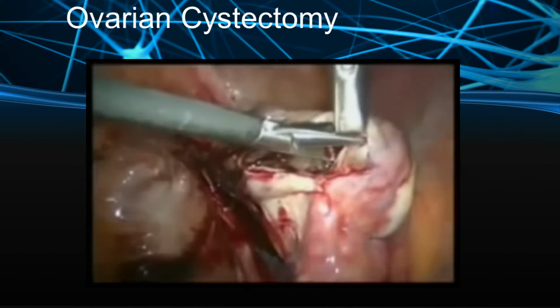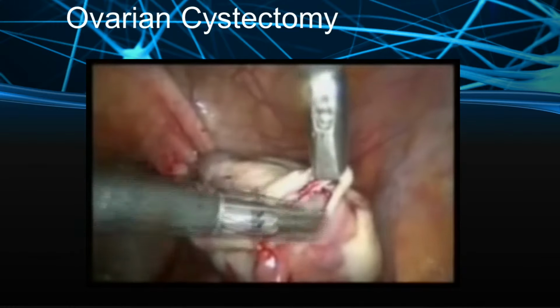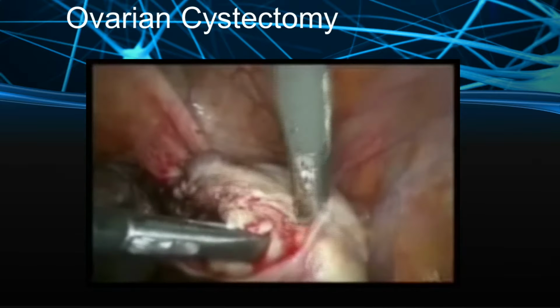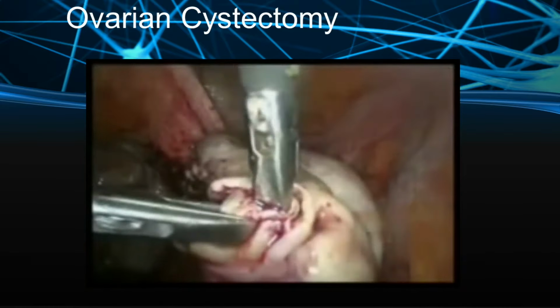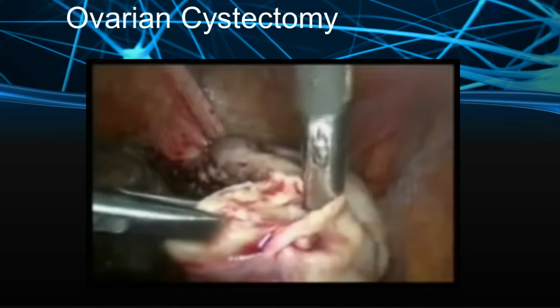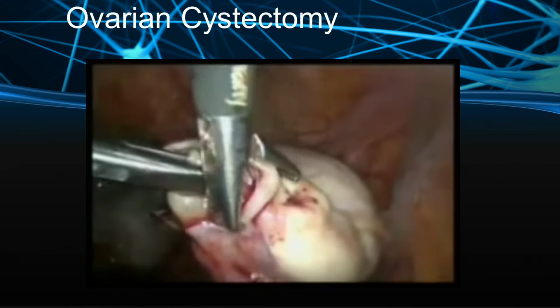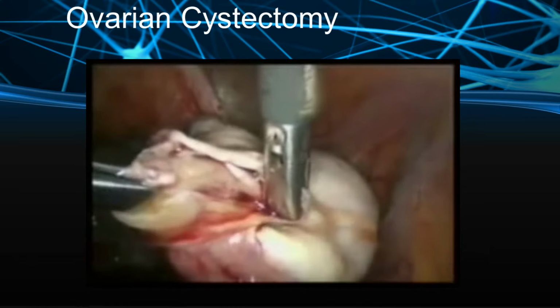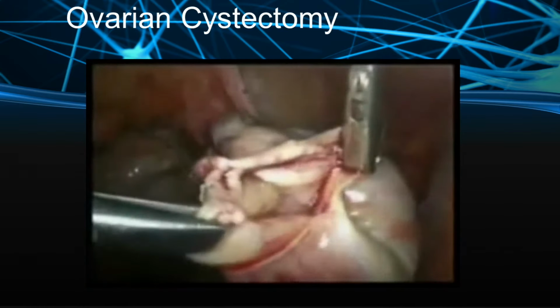As you know, endometrioma is a bad disease which has a recurrence chance, so GnRH should be administered postoperatively, and the patient should be told about the prognosis, and routine follow up is required. Many a time it is very edematous, and sometimes inside there will be small multiple pockets of chocolate cyst, that also has to be pulled out.